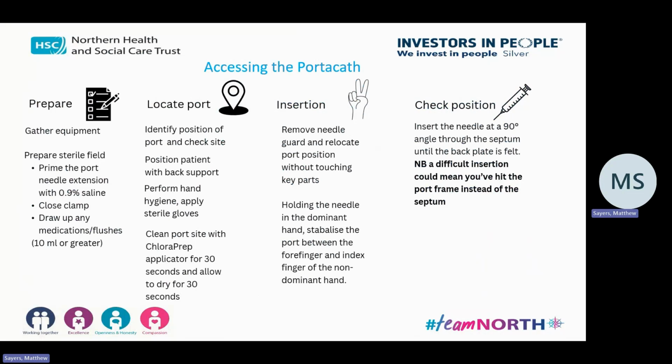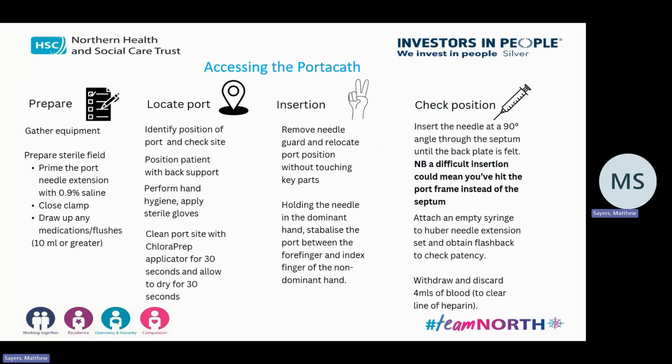Now, in a difficult insertion, if you try and push in and you can't push, you could be hitting the surrounding hard edge. That's your first thought, but there can be other reasons which we'll go on to. So if you feel like, no, that's not pushing in at all, just gently remove it, and then you can try again. Because you're going through skin, there is a little bit of pressure that is needed to go through.